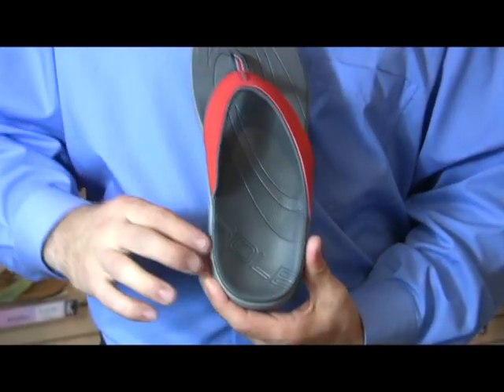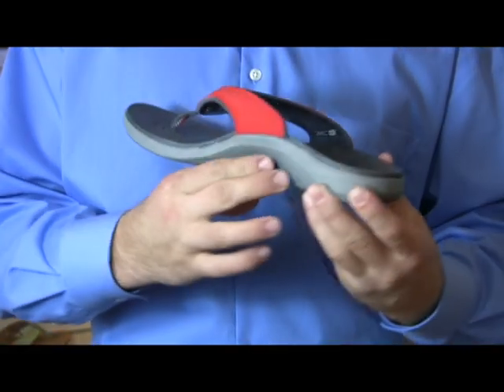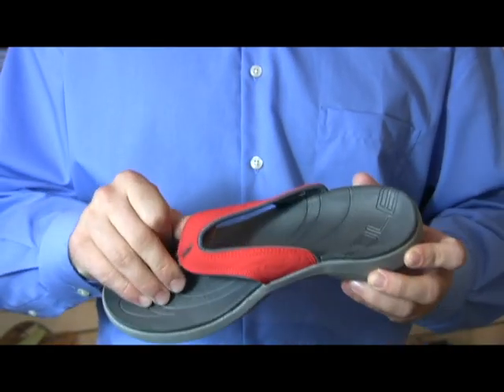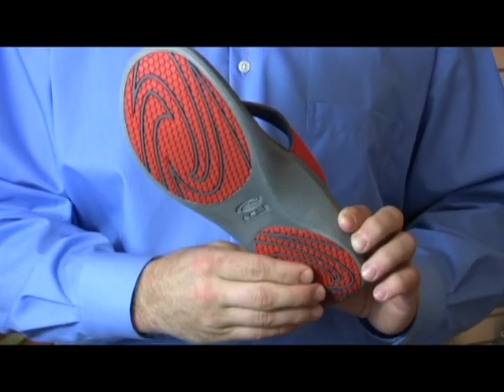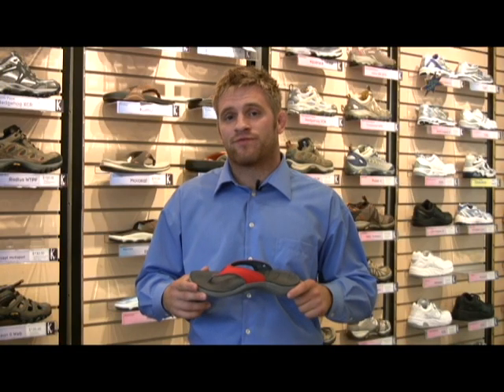Some of the features of this supportive flip-flop include having a nice deep heel cup, as well as a heat moldable footbed, along with very sturdy straps specifically made for men and women, as well as having a two-part outsole that's going to last you a lot longer. All of these features are going to help you stay active on your feet and pain-free.